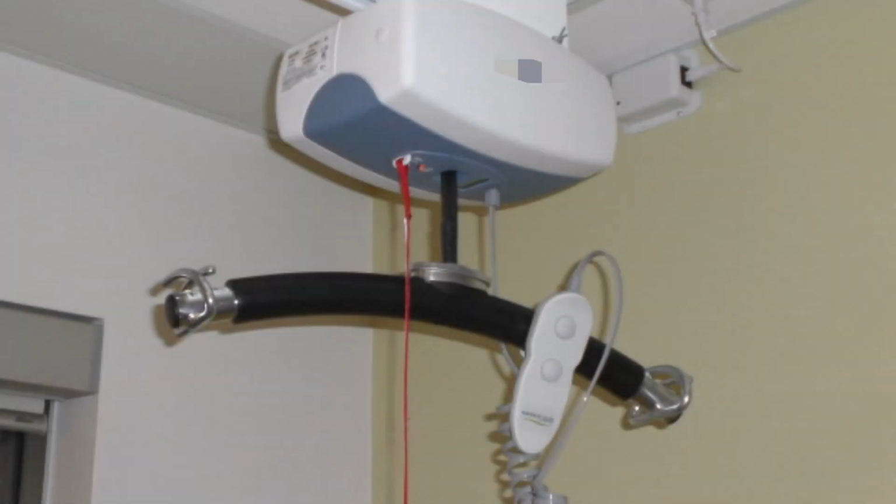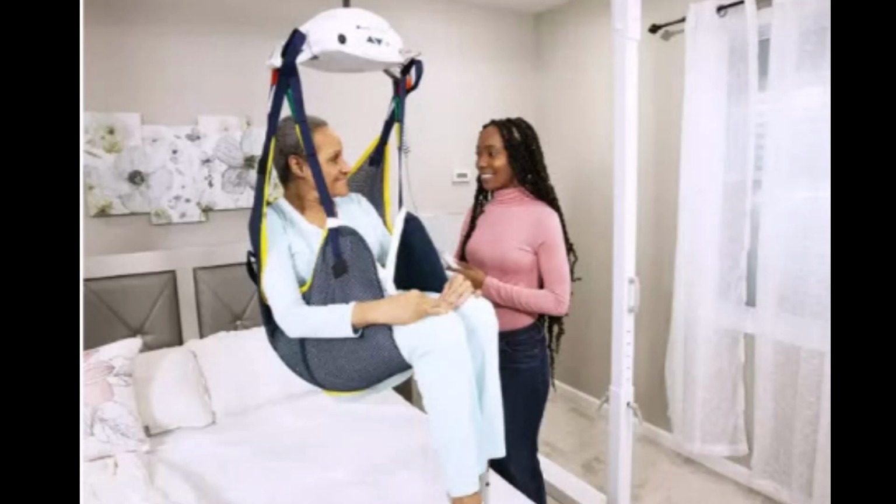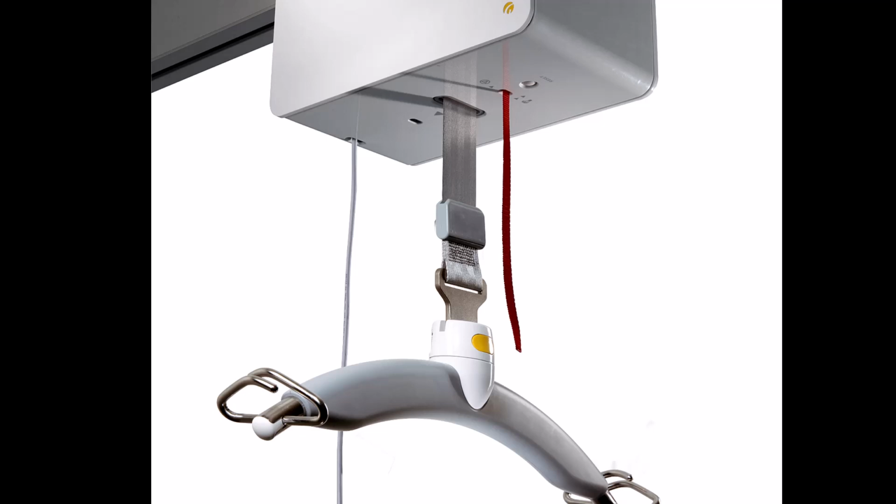Now, let's discuss overhead lift motors. Island Health uses two different brands of motors, both of which come in many lifting capacity sizes ranging from 440 to 1,000 pounds lifting capacity. They are run by rechargeable batteries and can have weight scale options too. They also have a carry bar which raises and lowers and has hooks for sling attachments.